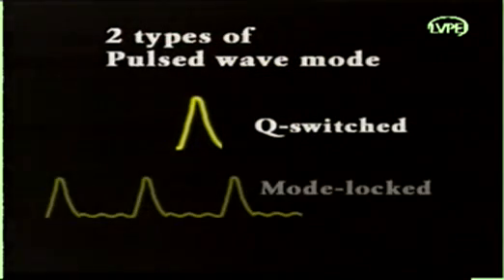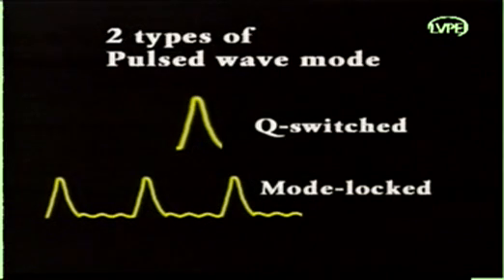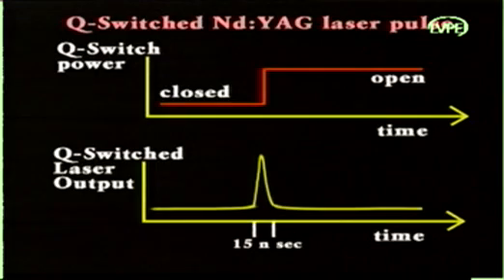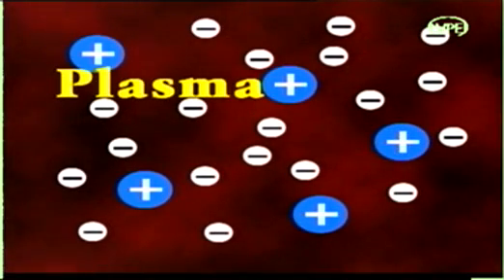Pulsed Nd:YAG lasers may be Q-switched or mode locked and are the two principal means of compressing the laser output in time to achieve high peak power. The high irradiance ionizes molecules in a small volume of space at the focal point of the laser beam, disintegrating it into a collection of ions and electrons called plasma. The plasma expands rapidly, producing shock and acoustic waves that mechanically disrupt tissues adjacent to the region of laser focus.